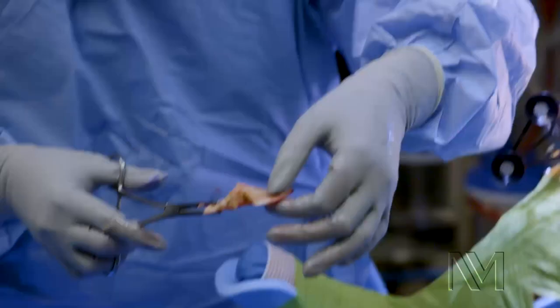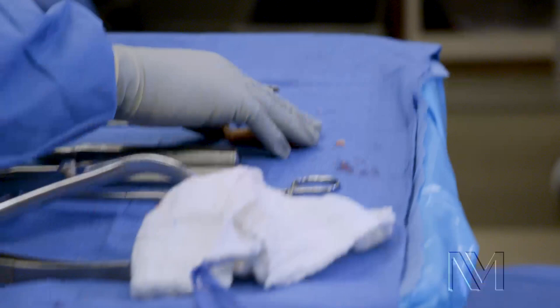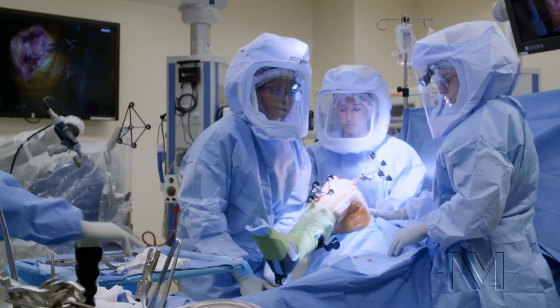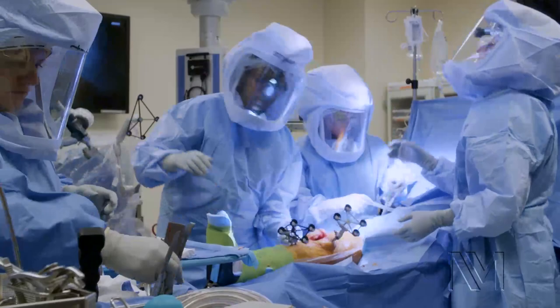Next, we need to take the remaining menisci out because we don't need it. We have a nice new implant that's going to create that cushion that the meniscus was previously doing. And what we're being careful about is protecting the ligaments and the arteries in the back of the knee.